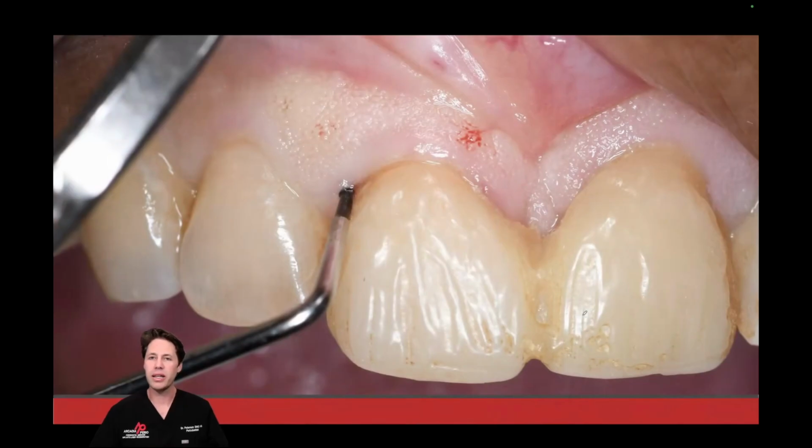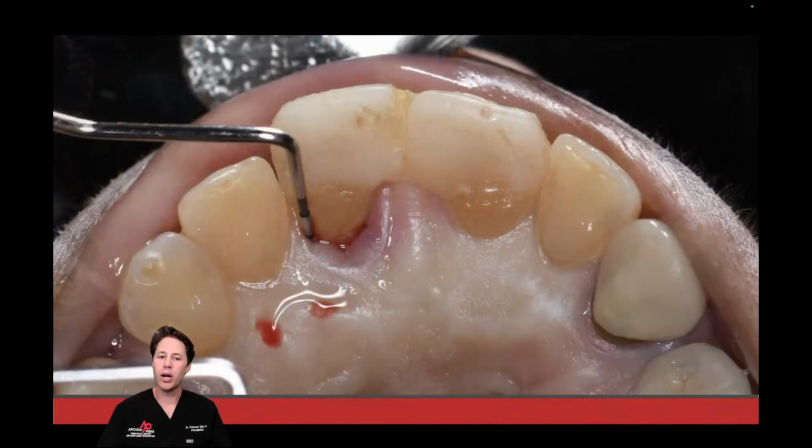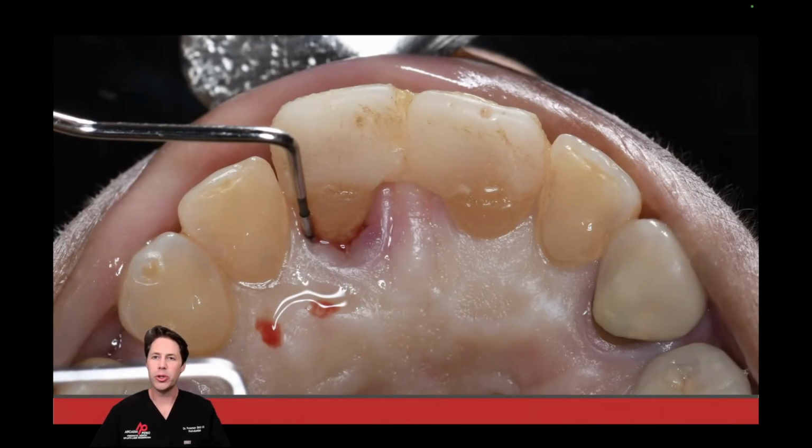Under local anesthetic, bone sounding probe depths are approximately 11 millimeters on the distal buccal aspect of tooth number 8. And as we move around to the palatal aspect, you can see here about 9 millimeters on the mesial palatal aspect. And as I walk that probe around the palate, we are at about 6 to 7 millimeters on the distal buccal aspect. This case brings about two important teaching points when it comes to using the PeriLase MVP7 laser.